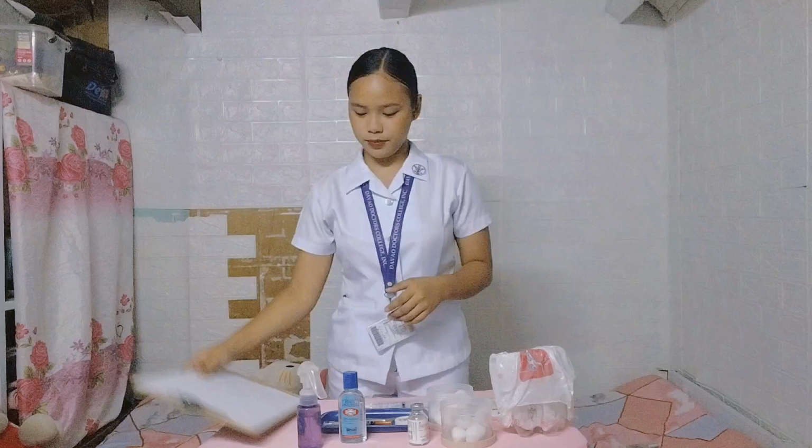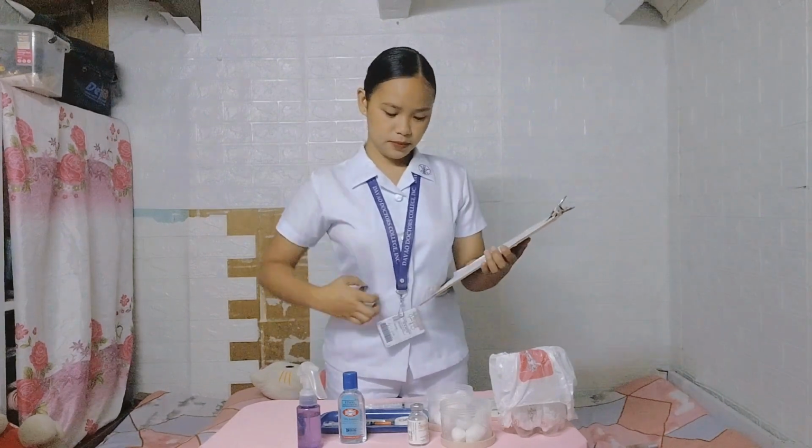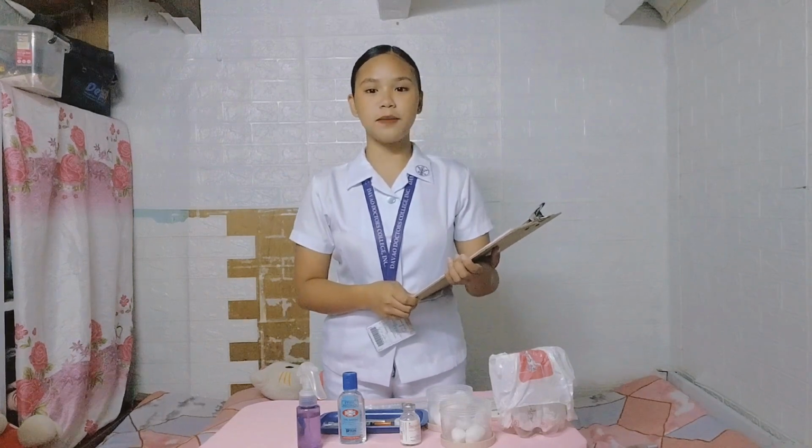First thing to do is to check the doctor's order and the medication administration record. Next, check the label on the medication carefully against the MAR to make sure that the correct medication is being prepared. In administering medication, we need to follow the 3 checks: read the label of the medication when it is taken from the medication cart, before withdrawing the medication, and also after withdrawing the medication.